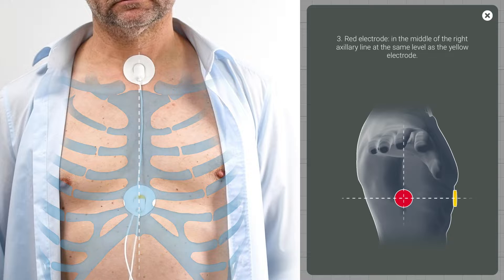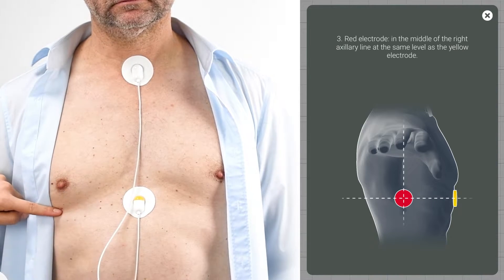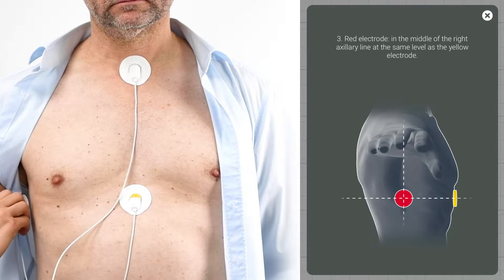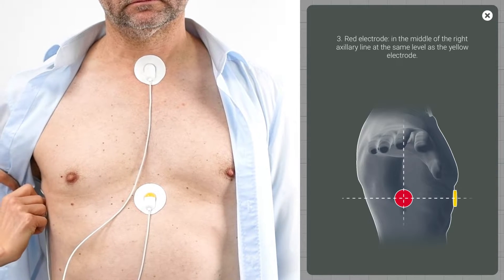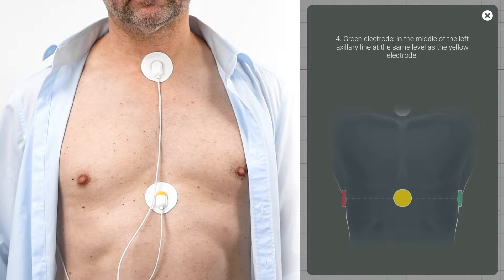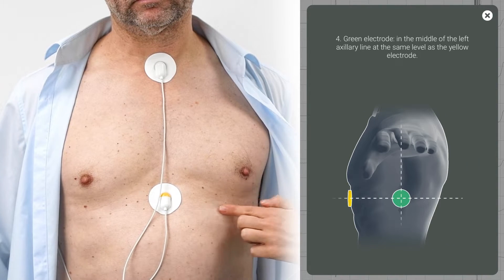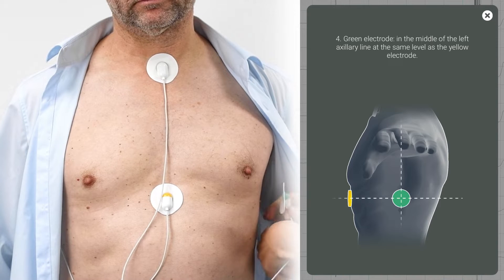Thirdly, position the red electrode centered under the patient's right arm on the level of the yellow electrode. Easy to remember: red and right from the patient's perspective. Finally, position the green electrode centered under the patient's left arm, likewise on the level of the yellow electrode.